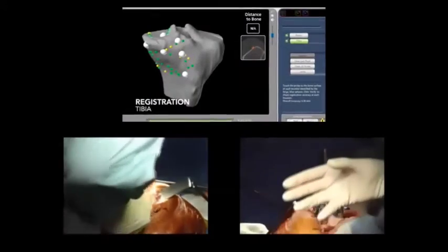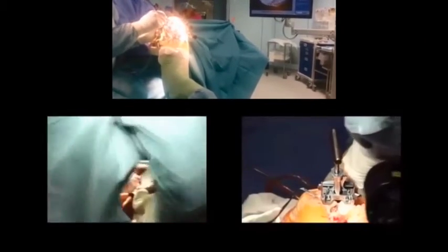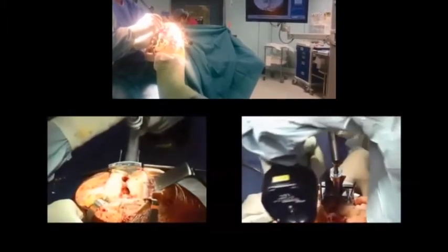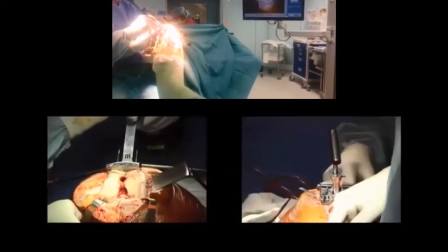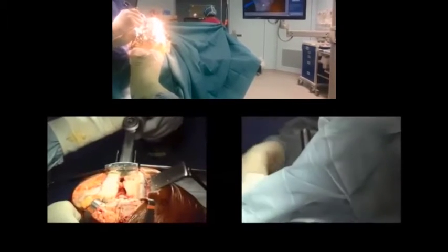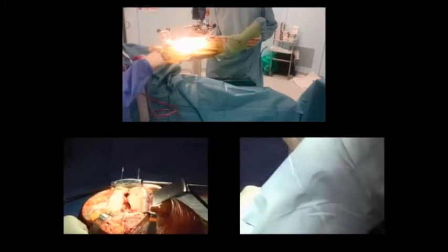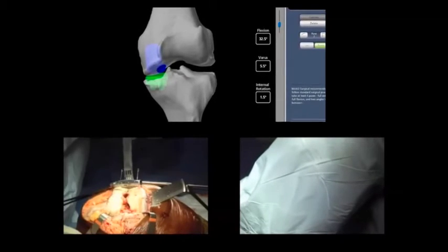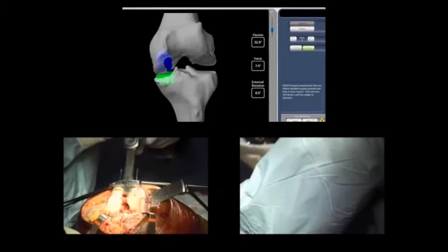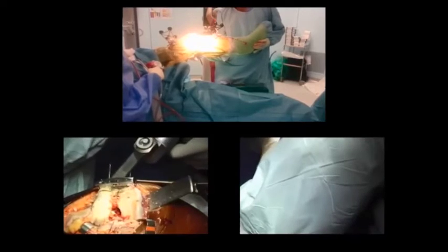Below we are now beginning to do the cuts of the notch, which will ultimately facilitate the fitting of the implant onto the distal femur. On the top we have begun to register most of the points of the tibia onto the computer, and at the bottom cutting of the distal femur has begun. Now on the top we are beginning to register the ligaments — we bring the patient through various angles and range of motion. This is an unprecedented step in knee replacement surgery; as you can see below, we don't do anything close to that.